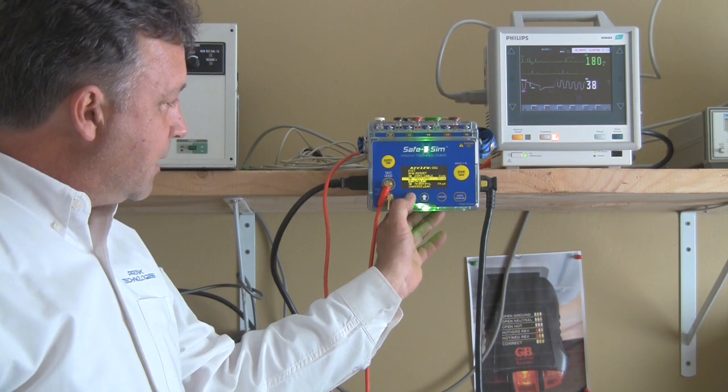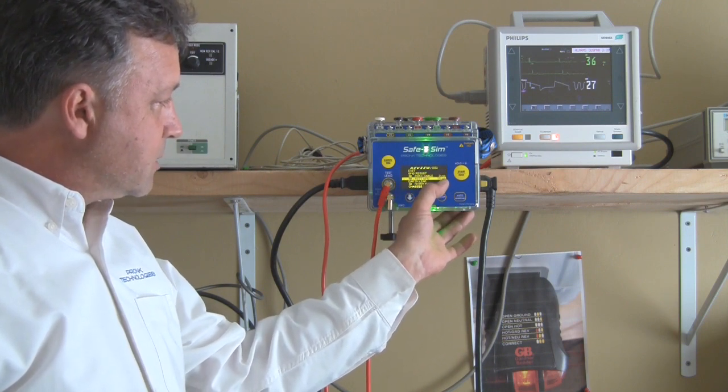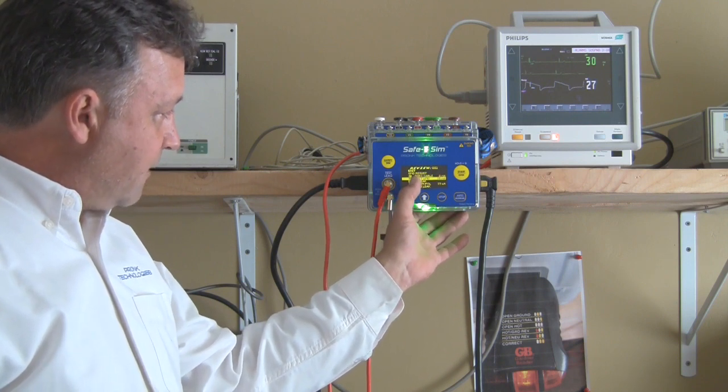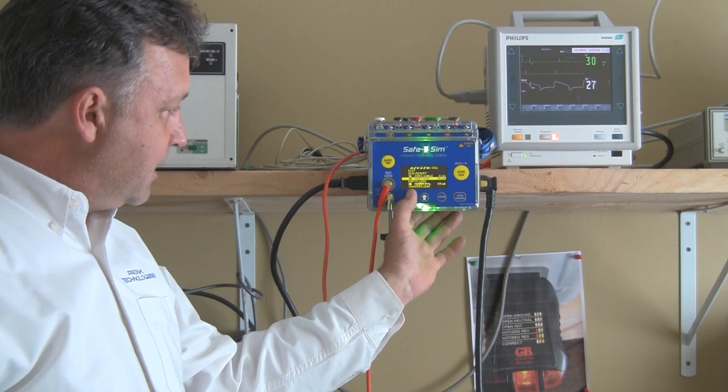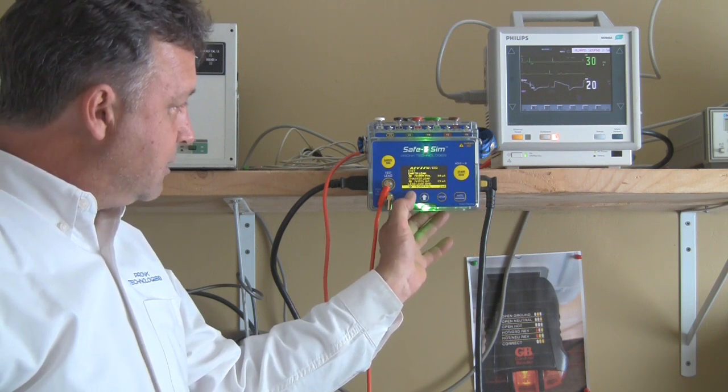From that screen I can scroll down and see all the individual tests and the results from the measurement that was taken. On the left you see a pass or fail with a P and an F, and on the right you see the measurement value. You can scroll through those if you need to.